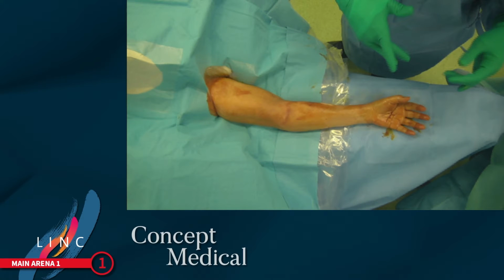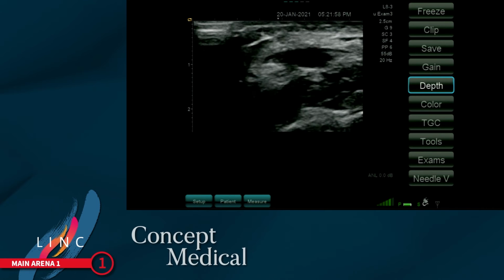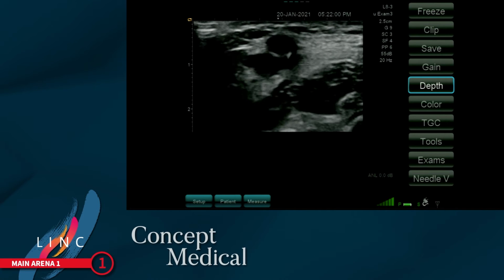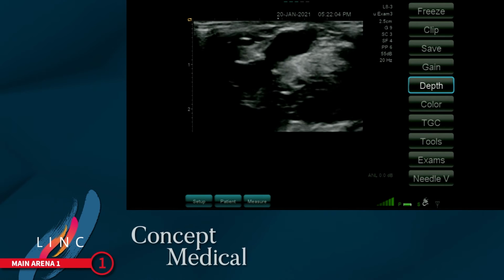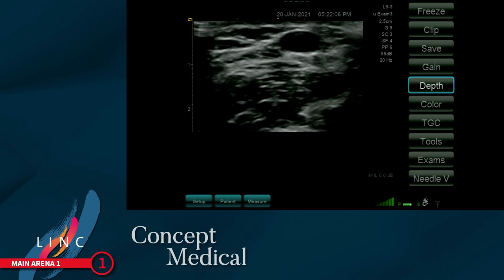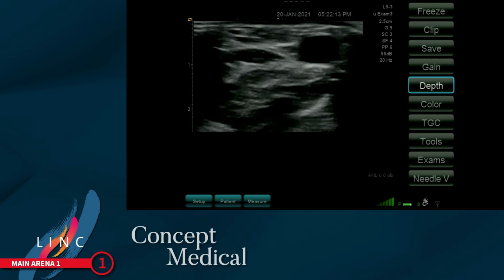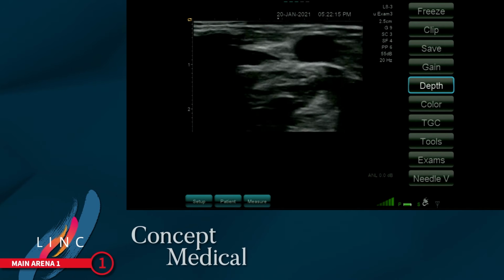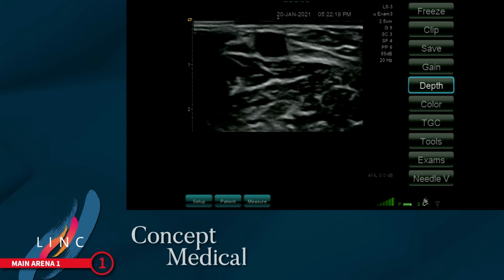This is our operating room. We do this in the hybrid operating room, and this is the patient positioning over here. The duplex ultrasound is initially performed from the brachial artery. You can see the anastomosis there in the middle of the screen, showing widely patent, and going up the upper arm, going towards the shoulder. It looks still pretty decent, and very soon we will see the area of concern.